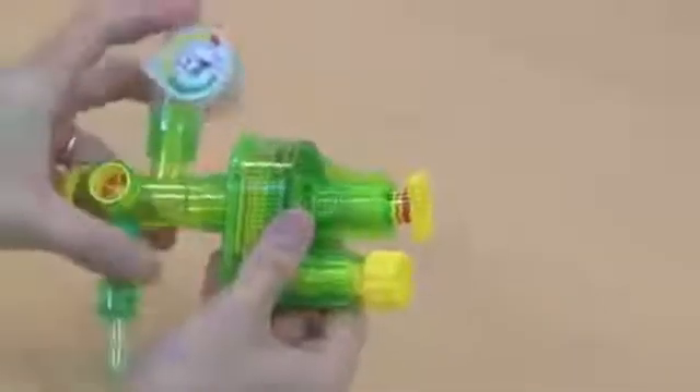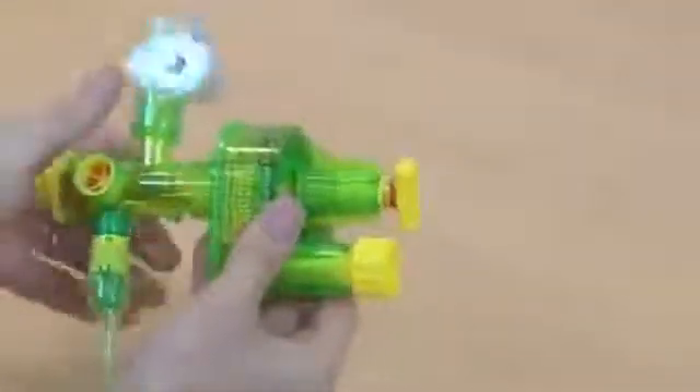The device comes pre-assembled in its packaging. The first step is to cut the cable tie on the rate control and pressure control knob. After that, the oxygen tubing needs to be connected to the device. It is worth knowing how each component fits together — the Safety T-piece and Modulator connect, and finally the manometer is attached to the patient side of the circuit.